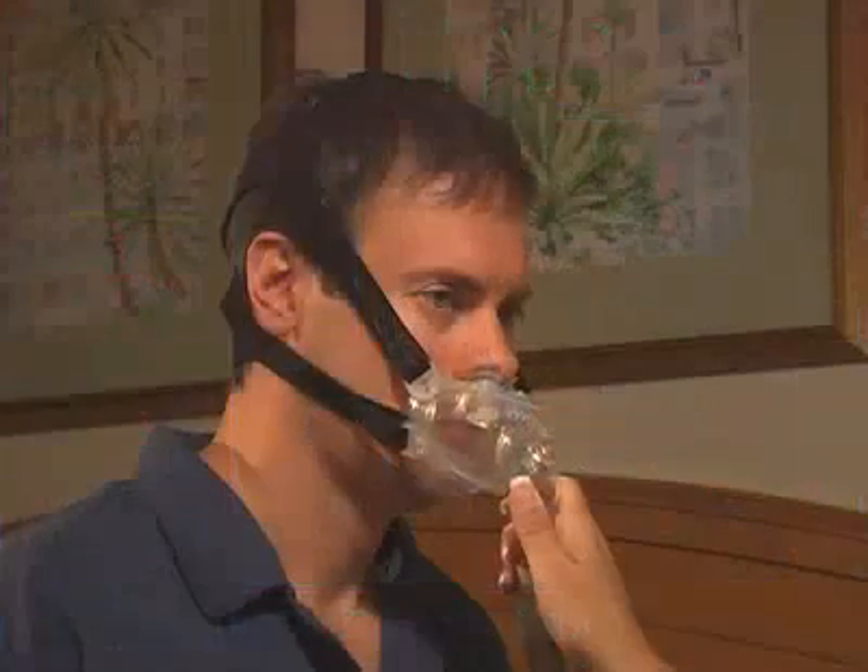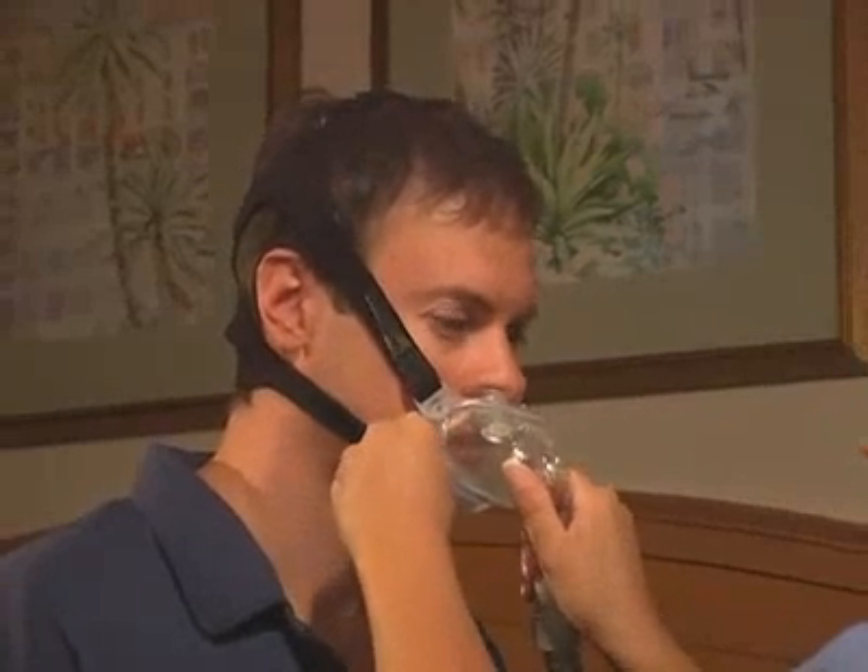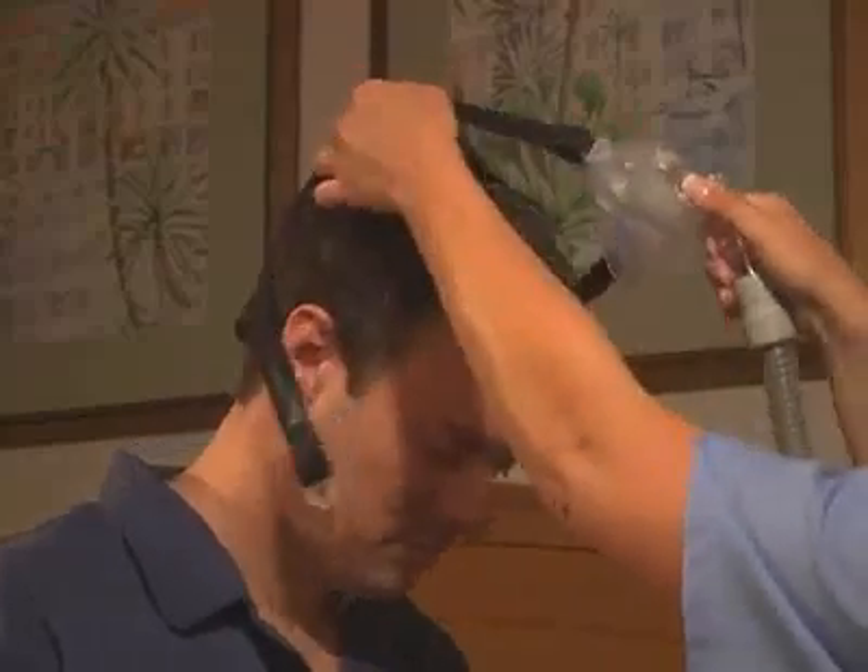To remove the hybrid, gently press the interface toward the face and push one of the lower quick-release buckles forward until it unsnaps. Pull the interface and headgear away from the patient's head.